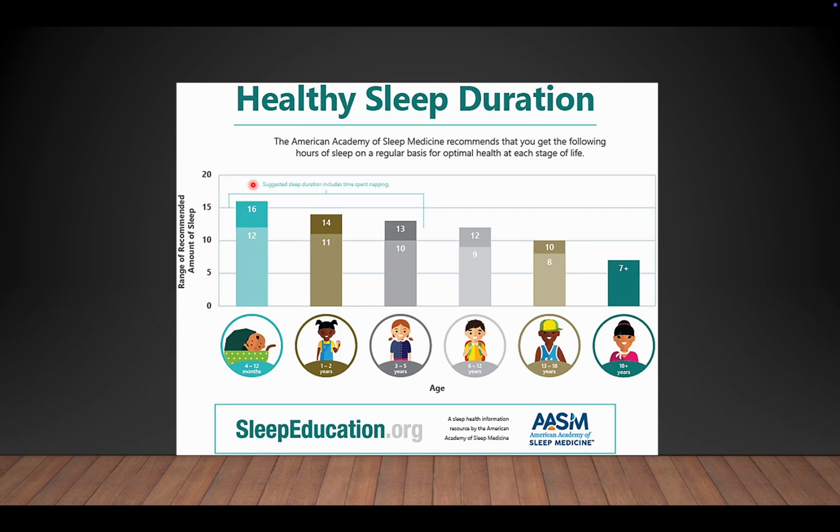Sleep needs to be addressed based on the children's age group. The recommendation is at least 8 hours of total recording time, with a minimum of 7 hours, but the minimum sleep hours need to be recorded based on the age of the patient.